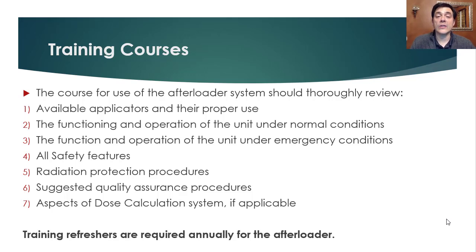There is an annual training refresher required for the afterloader's emergency procedures. So you should be keeping up on the educational part of the afterloader training. The Nuclear Regulatory Commission requires that you have at least an annual training in the emergency procedures of what to do when the source stays out or stuck in an applicator.